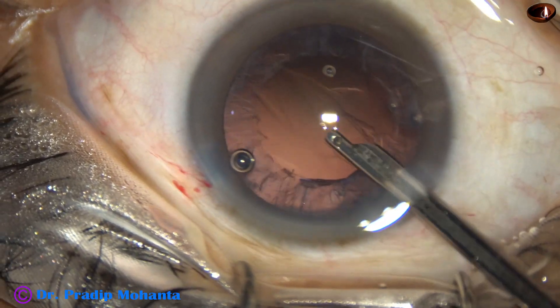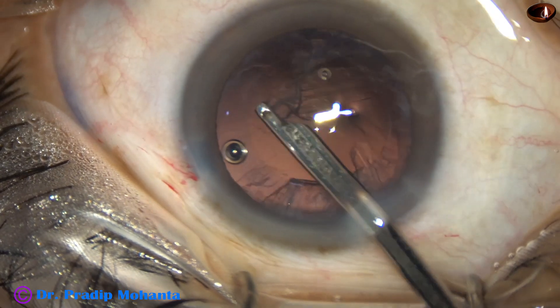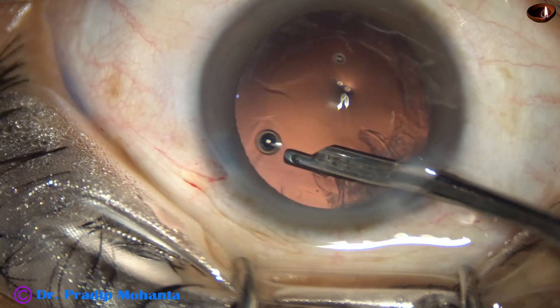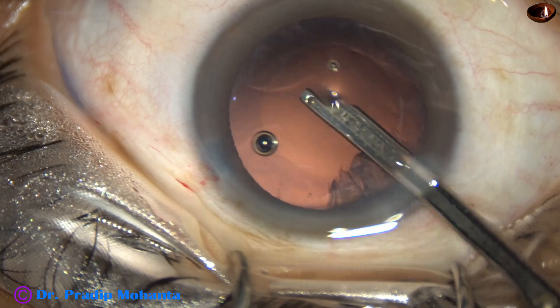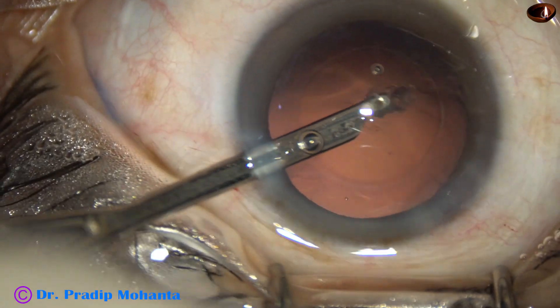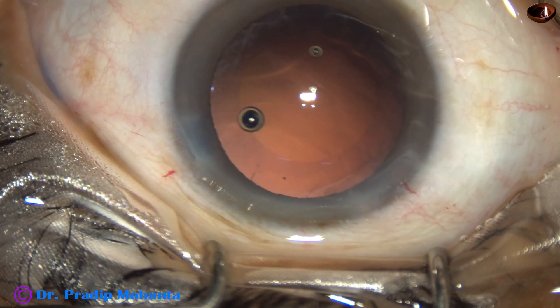The Simcoe applies a little vacuum, places it at the main wound, depresses the posterior leaf, and it comes out. Now in this case I'm using this Simcoe itself for removal of the cortical lens matter. I have made the side port about 1.8mm so that the astigmatism induced by the main wound can be neutralized to some extent and this instrument can easily go into the anterior chamber. With only one side port of 1.8mm rather than two ports of 1.2mm each, we can easily go through it and remove the sub-incisional cortex.